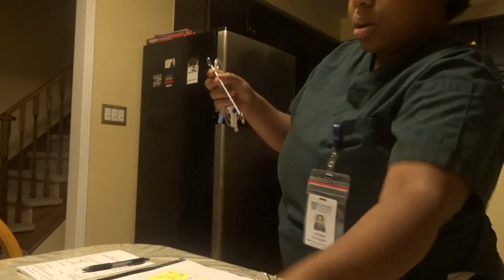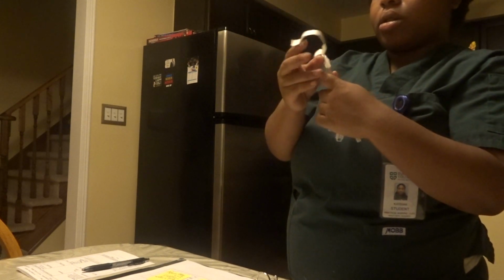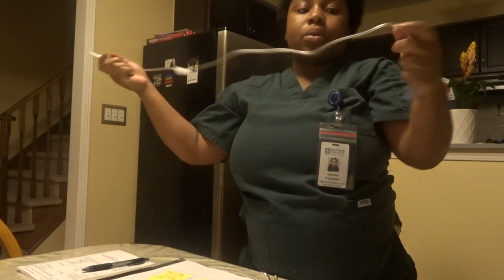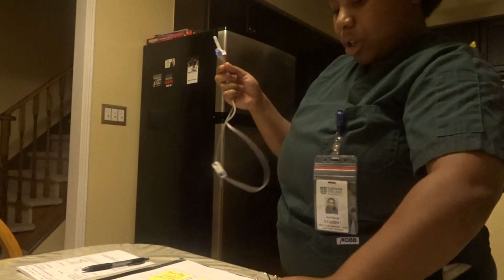I sanitize my hands, wash my hands right here. I'm gonna take this sticker off, and then I'm gonna unwind, and then I'm automatically gonna lock this. So it's locked. I'm gonna take my medication, and just using sterile technique.